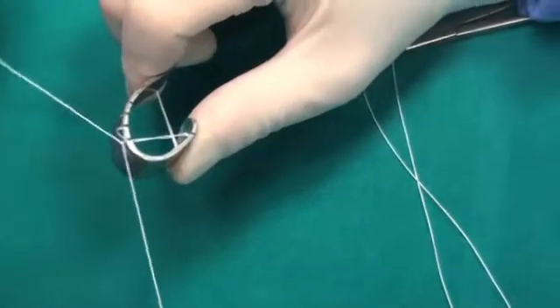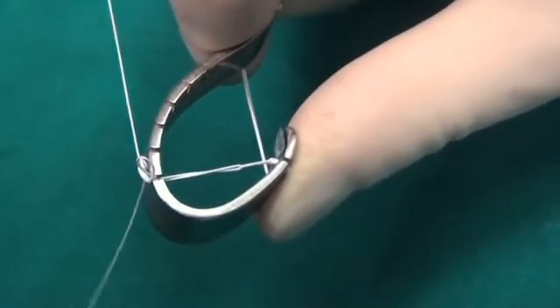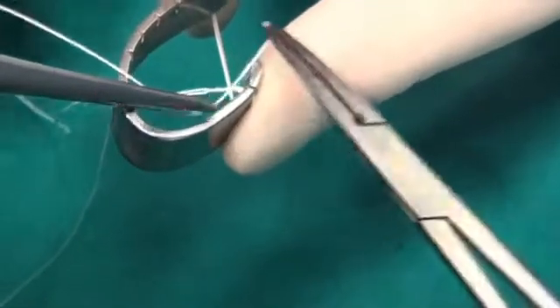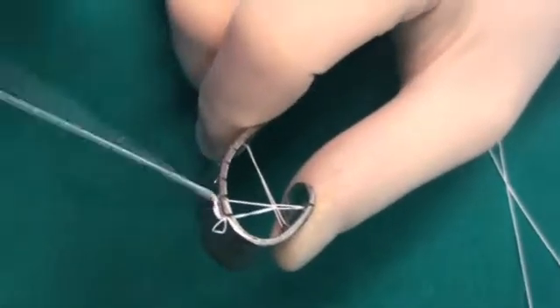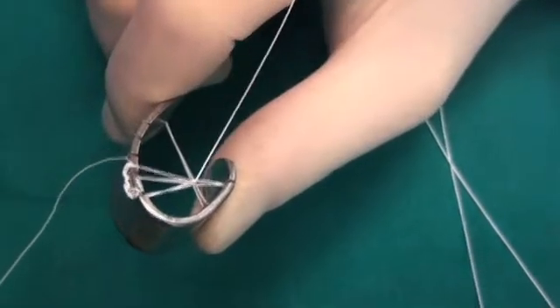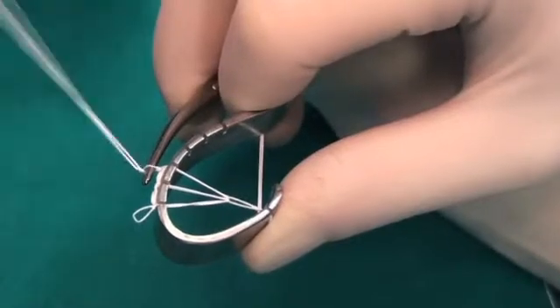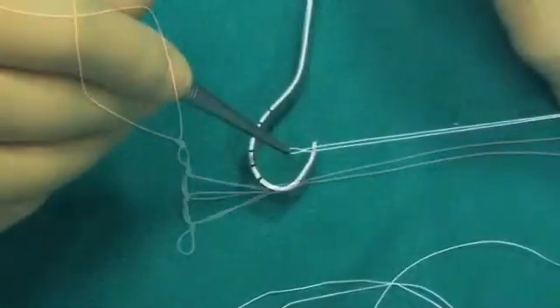Then a sequence of many knots is made till the next incisor, when we go down, passing through the loop and returning, continuing the knots till the next incisor. After the completion of the first set of corde, we make another loop in the middle to facilitate the implantation, because this loop will match with the middle of A2.